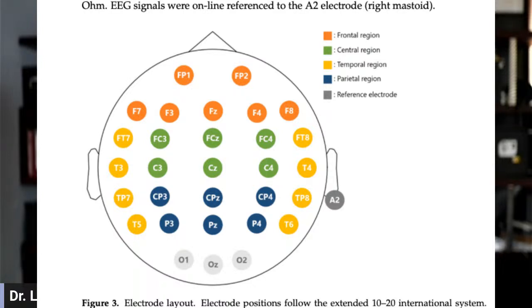And these little places, FP1, FP2, F7, T3, T4, are places where you'd put a site or an electrode to try to pick up information. When I talk to patients and even friends, they're concerned: are we giving electrical energy into the person and shocking them? That is not what we're doing. Instead, we're registering this, the same way as if someone took someone's pulse. They're feeling the pulsation, right? They're not providing a pulse to that person. Rather, they're being able to perceive it. And that's what we're doing with this.